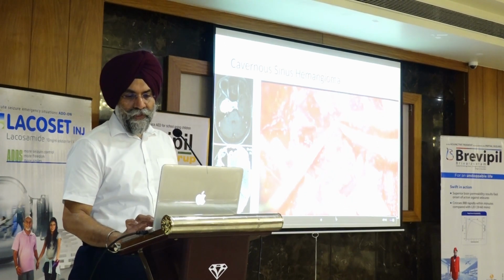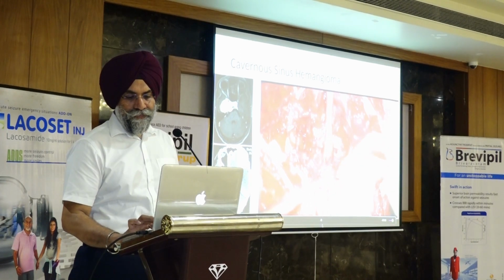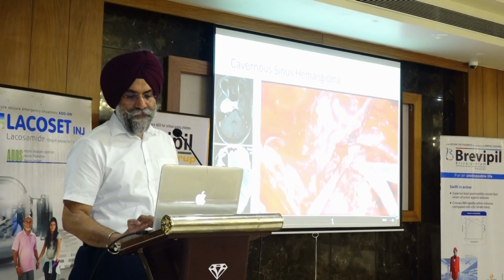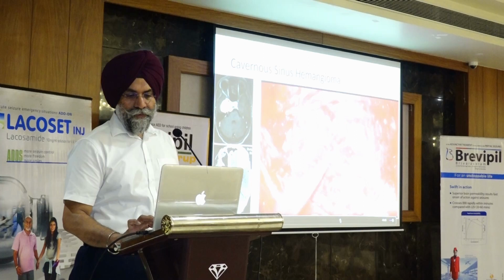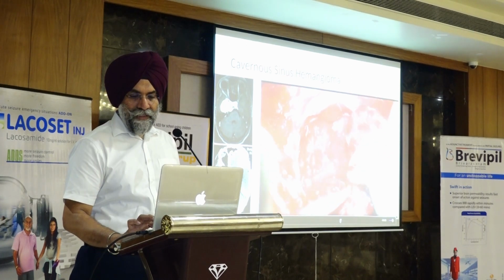So once you are coagulating all around, it loses its turgidity. The lateral component from the cavernous sinus, the dissection is now almost done. It is taken off.